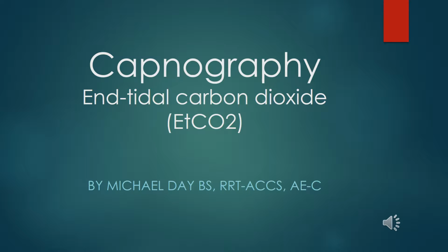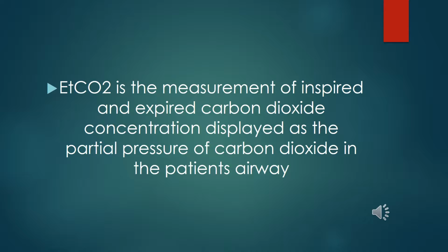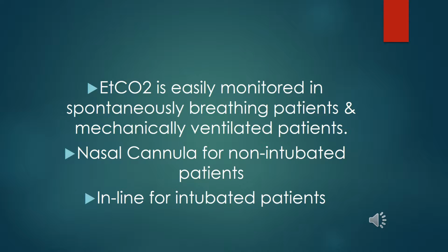This is a PowerPoint presentation on capnography and end-tidal carbon dioxide monitoring by Michael Day. End-tidal CO2 is the measurement of inspired and expired carbon dioxide, commonly displayed as the partial pressure of carbon dioxide in the patient's airway. End-tidal CO2 can be continuously monitored in both a spontaneously breathing patient and a mechanically ventilated patient.